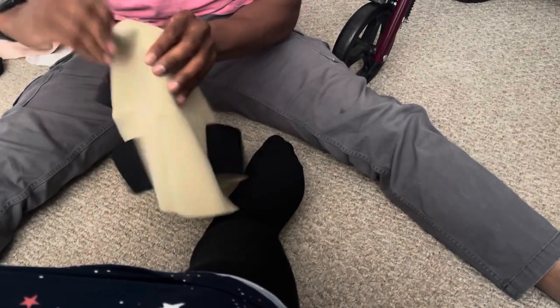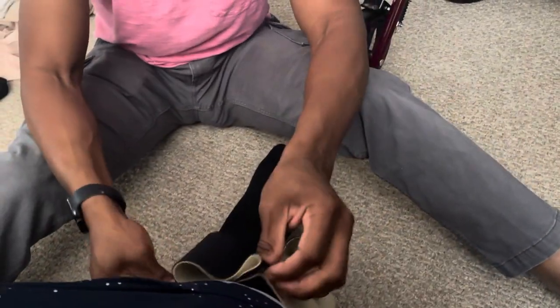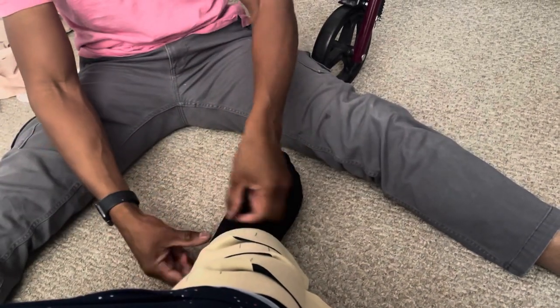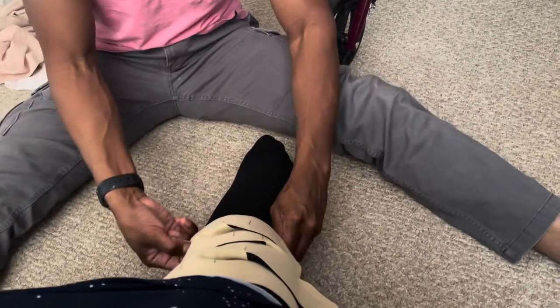After you do that, you will see that there's a top label on the garment. The black side of the garment goes against the black sock, and you want to put it about two fingers below the knee. Once it's on the back, you're going to take the straps and loosely apply it — you don't want it too tight, and it doesn't have to be perfect or even. After you apply it, adjust it so that it starts right at the ankle, right where the compression ends at the sock portion.